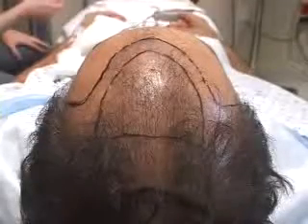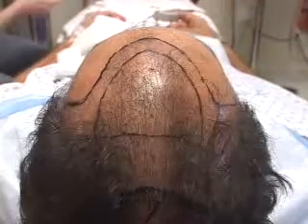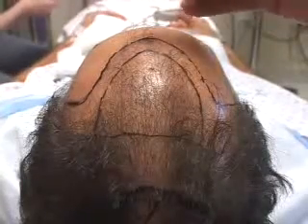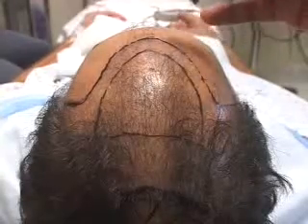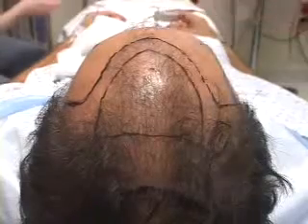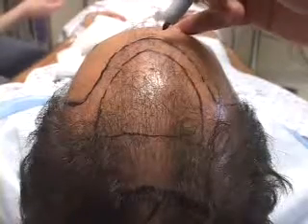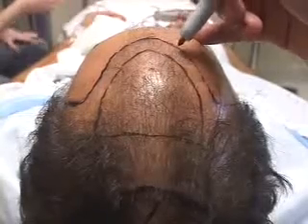We're about to start a hair restoration on this gentleman, and I think this is a great example of all the different parts of the scalp that need to be reconstructed. What you're looking at right here is the hairline zone. As we move backward, all the angles of the hairs are going to be in this direction, straight forward. That's very, very important so that you can create a very dense wall of hair so you can't see through it. You don't want to start splaying the grafts out.